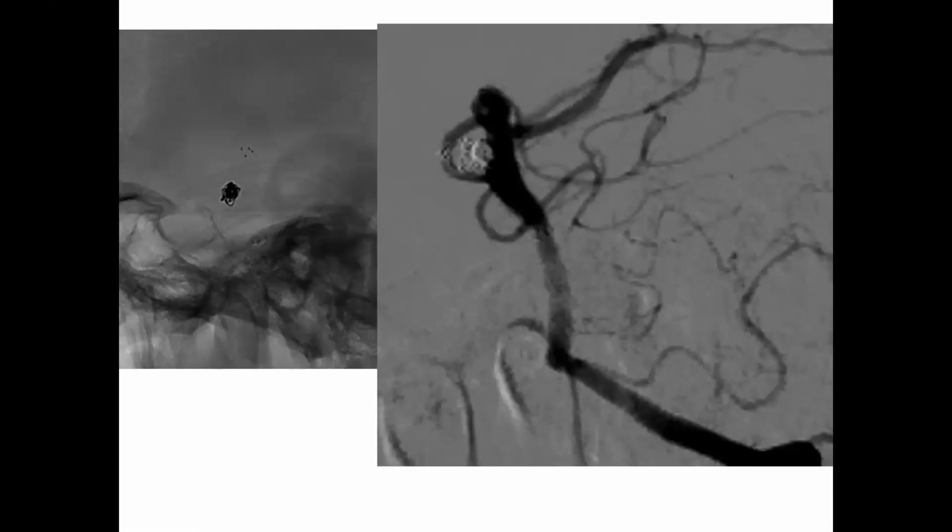Another dissecting spontaneous aneurysm. This is a particular situation. I put one Neuroform stent, similar to Atlas, an auto-expandable stent, and some coiling. But 1 month later, it reopened. No, it's not stable. This is the proximal part of the stent.